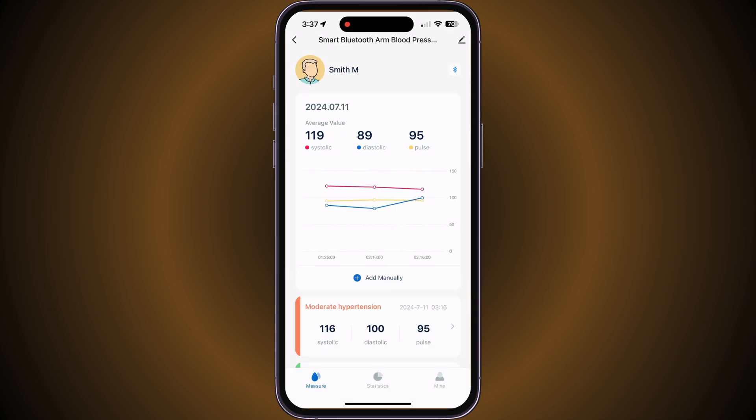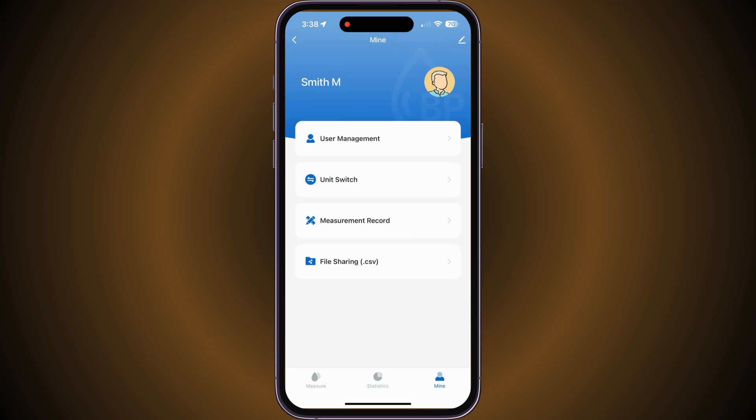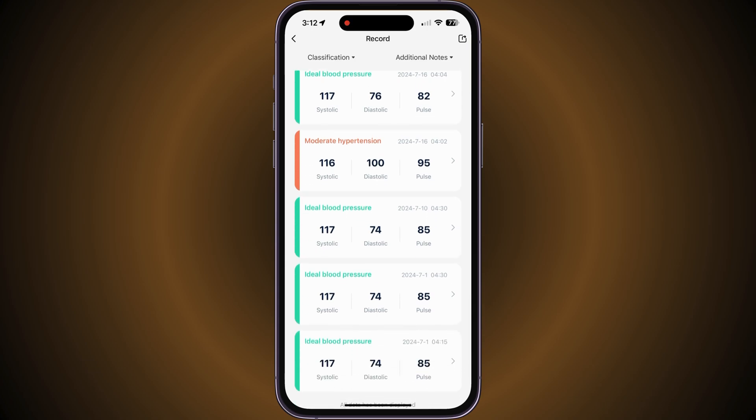Also on the main screen of the Smart Blood Pressure Monitor, you will have options such as statistics to view weekly, monthly, and yearly reading trends, as well as the option for user management, unit switching, and measurement record, which allows you to view all past blood pressure readings.